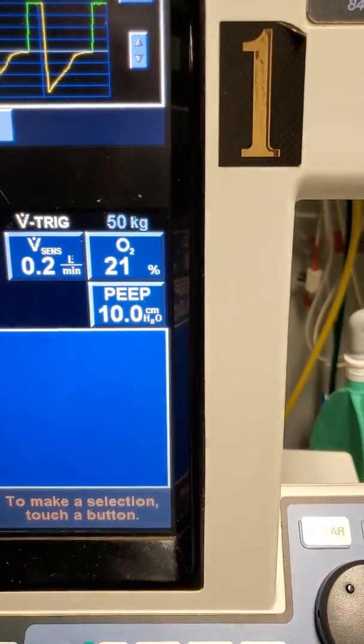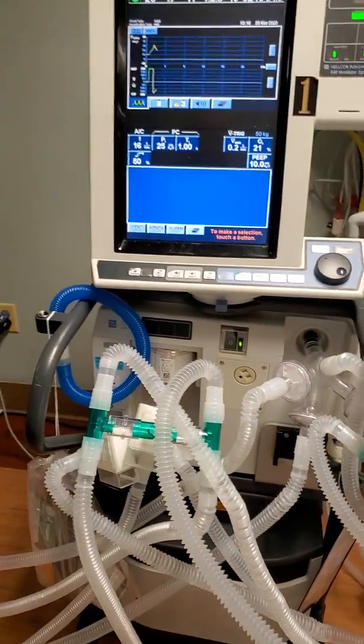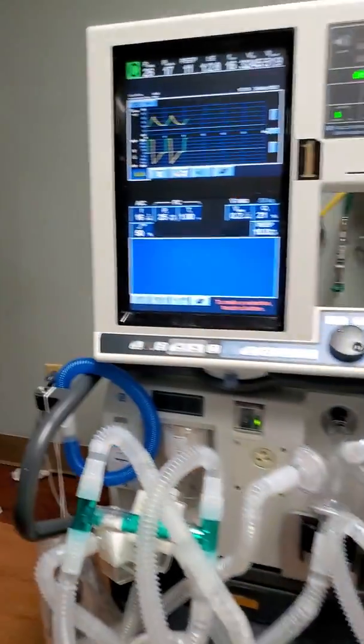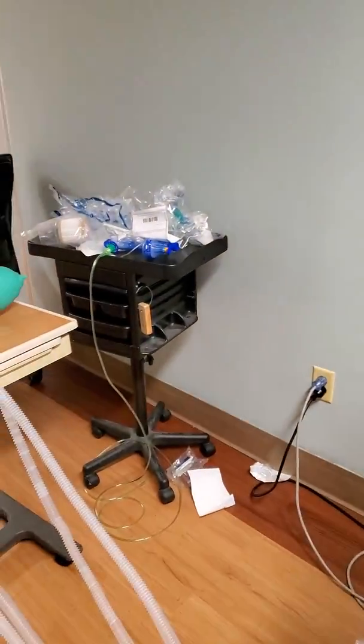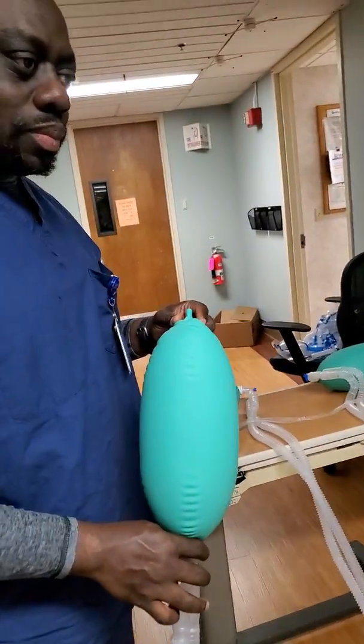And we put a PEEP of 10, and we can go up on the PEEP if needed. Each of these patients is getting a volume based on the exact settings that we have set up, and we are using the pressure control ventilator. With this mindset, with this strategy, we can do ventilation for 7 at this time, but far more.